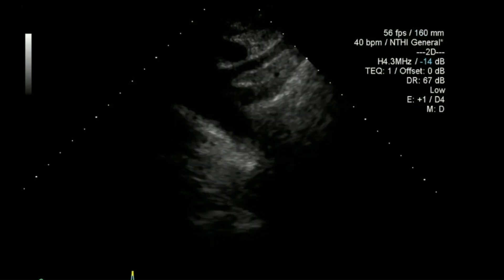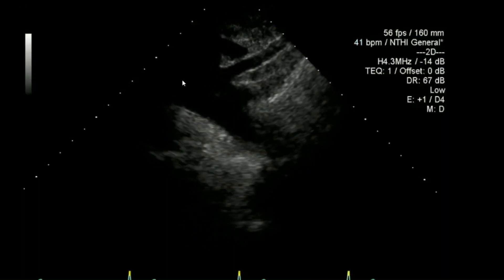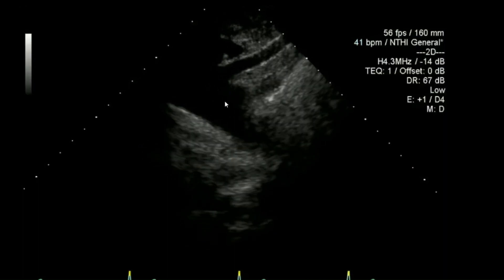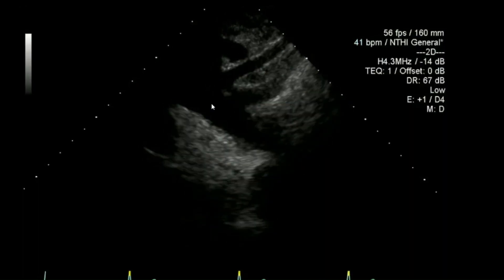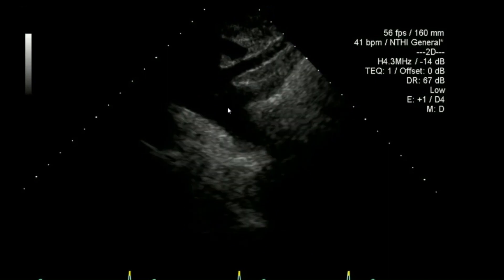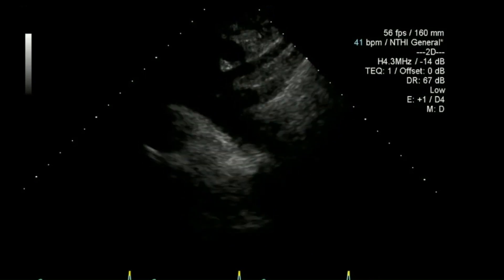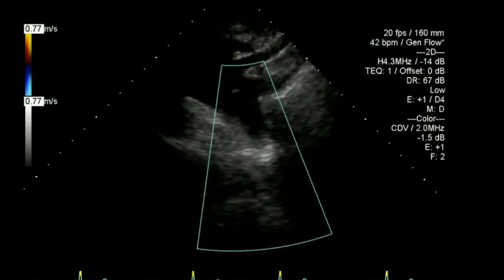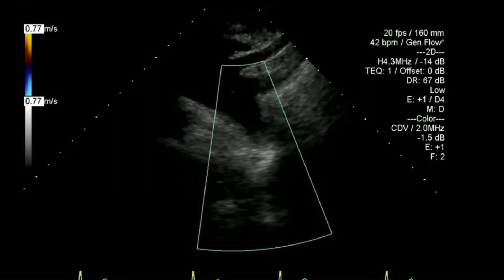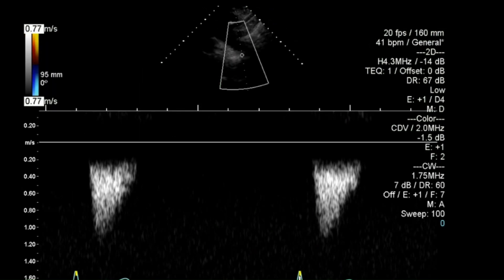From here I've gone up to the aortic arch — you can see vessels coming off, and I want to consider size as well as colour for coarctation. I have colour flow and Doppler demonstrating that there is no abnormality there.